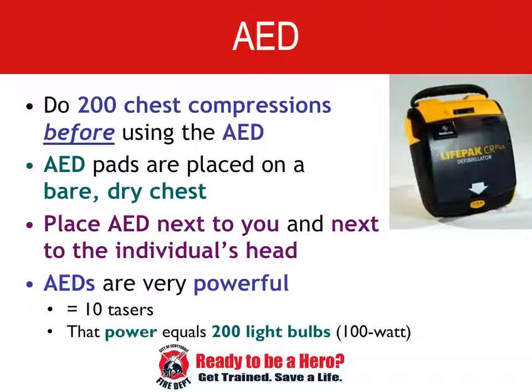If the person is not responsive, you will begin compressions. It is completely safe to touch the patient at this time. The pads stay on, the machine stays on. The AED will time itself for 2 minutes, which means you will do about 200 compressions. It will analyze and shock if necessary every 2 minutes.